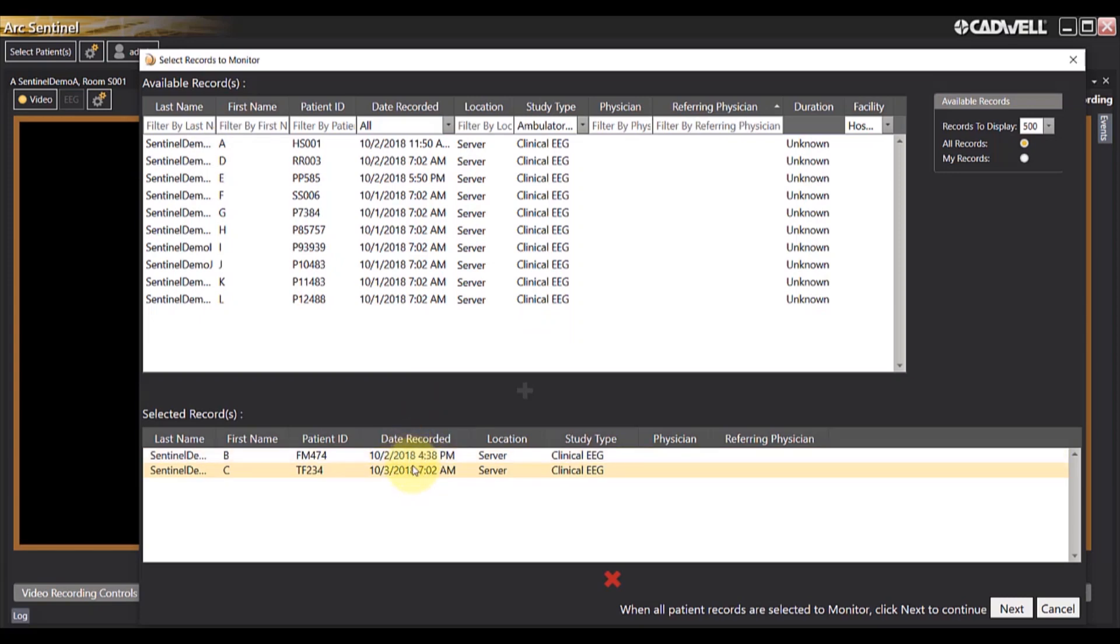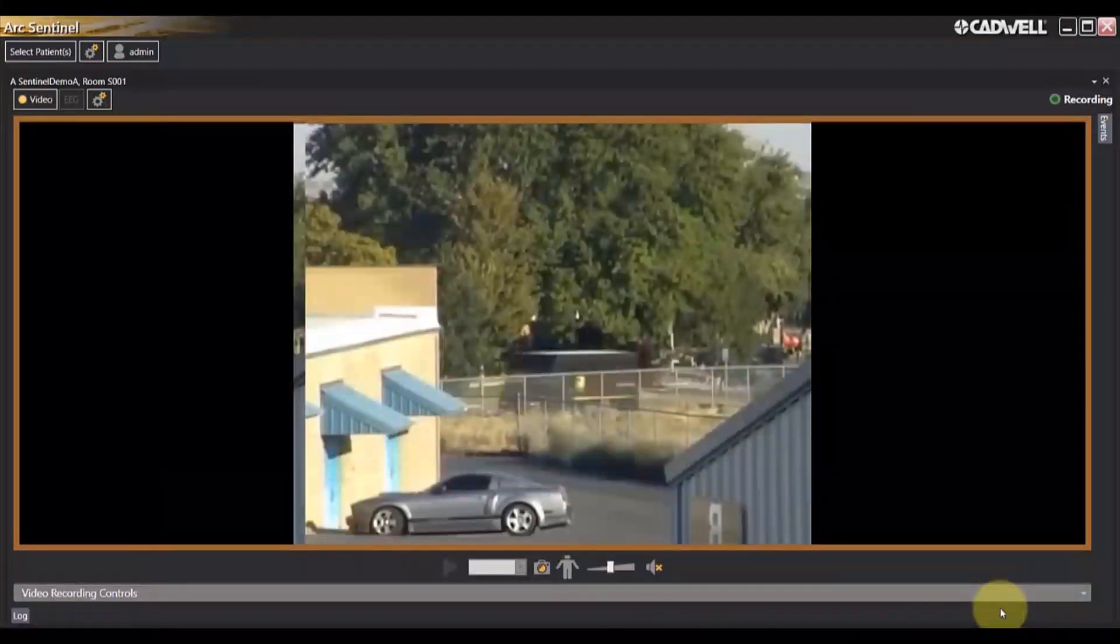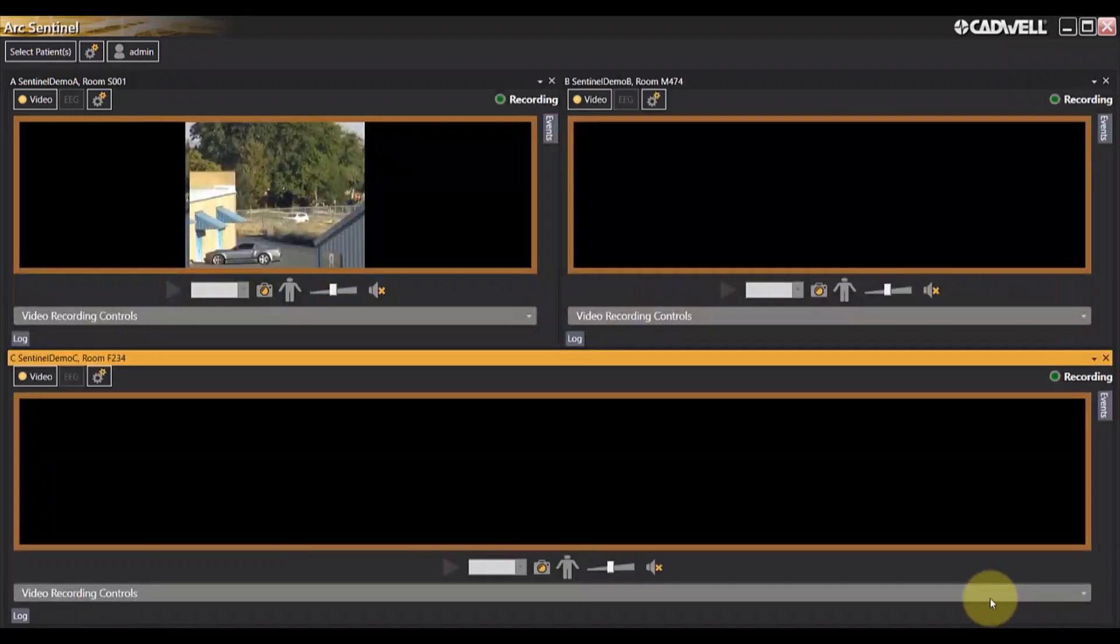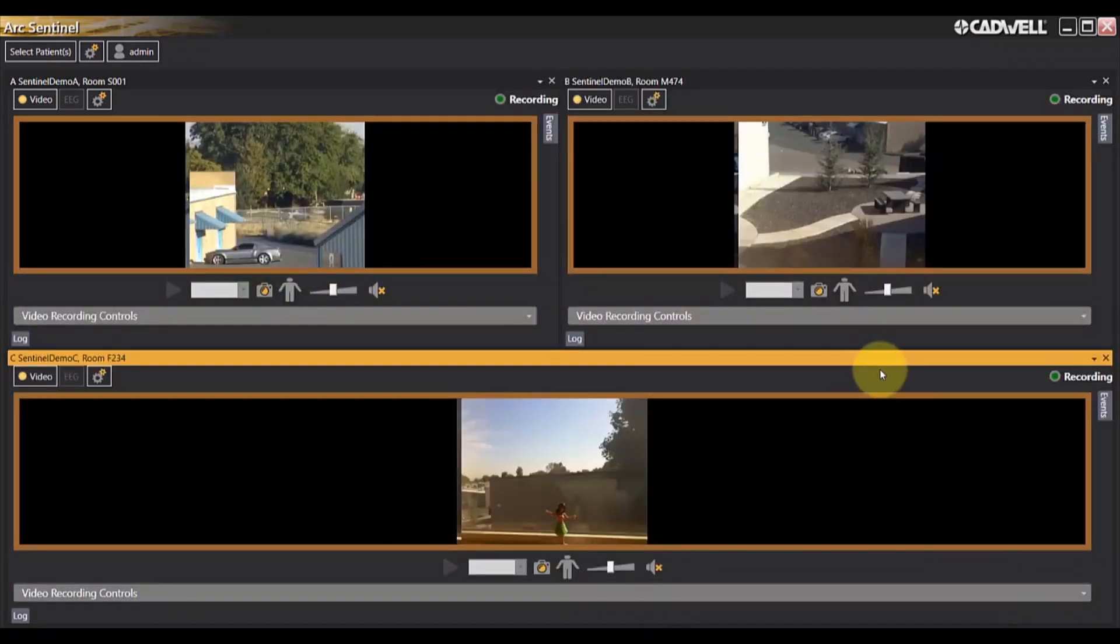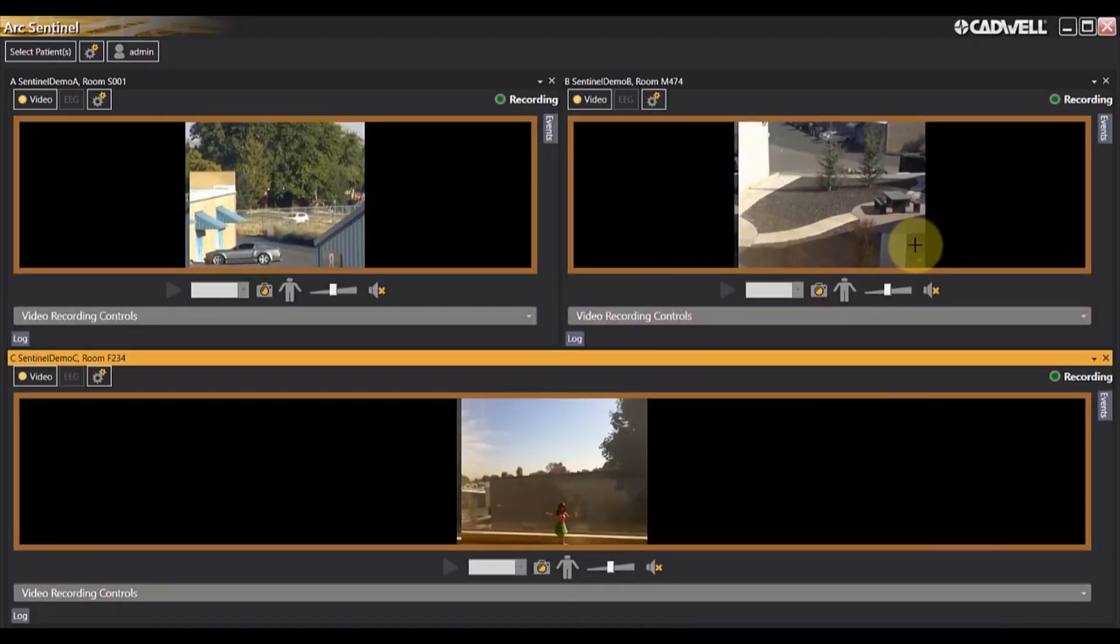Once you have selected the additional patients, click Next. This process will automatically add additional rooms to your monitoring screen.